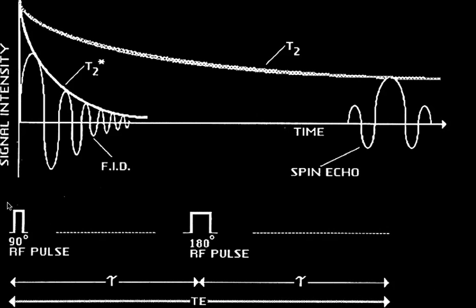This is a much stronger signal than the weak little signal we get back from the nuclei. So typically you shut off the receiver electronics when you give the 90-degree pulse, and you wait for everything to calm down. So people tend to keep all of the receivers off until we get close to the echo.